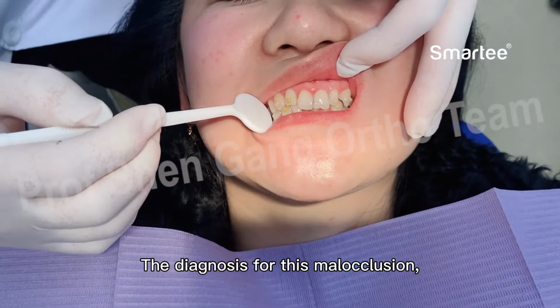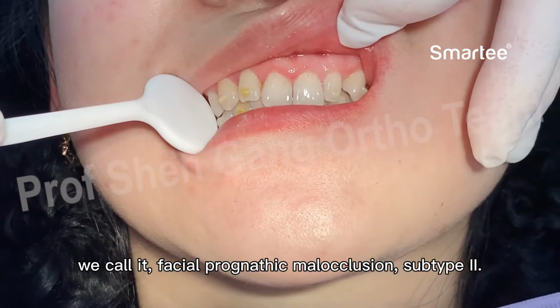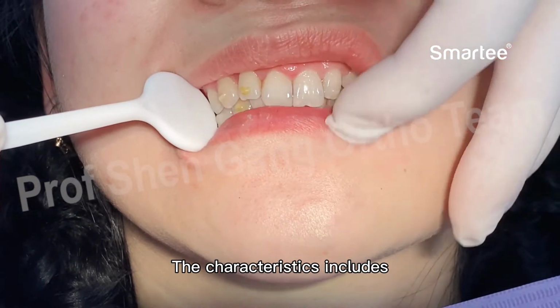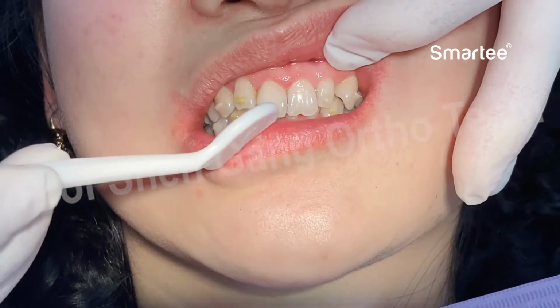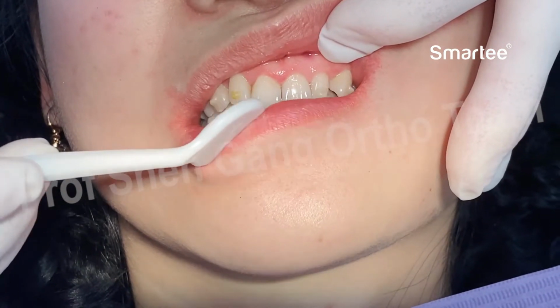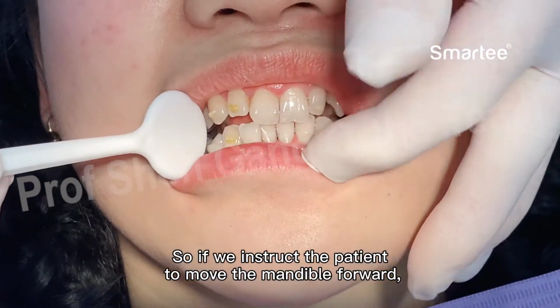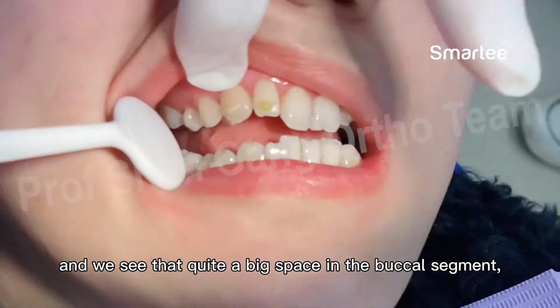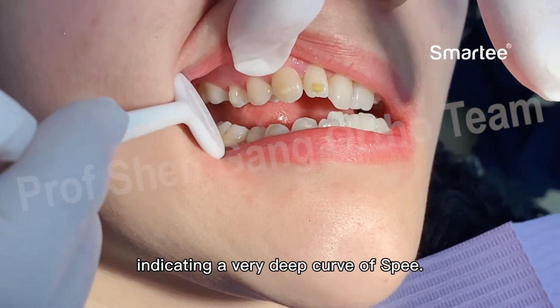The diagnosis for this malocclusion, we call it facial retrognathic malocclusion subtype 2. The characteristics include the deep curve of Spee, the deep overjet, deep overbite, and the retroclined upper frontal teeth. Facial appearance is not too bad, quite acceptable. If we instruct the patient to move the mandible forward, we see quite a big space in the buccal segment, indicating the very deep curve of Spee.